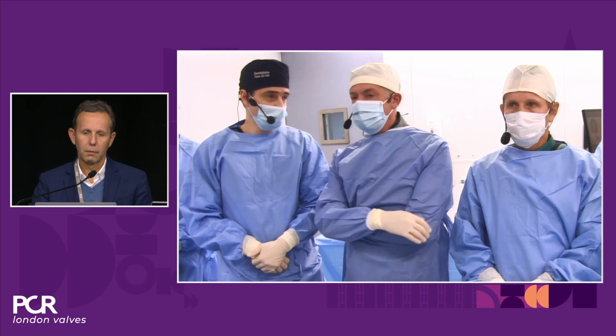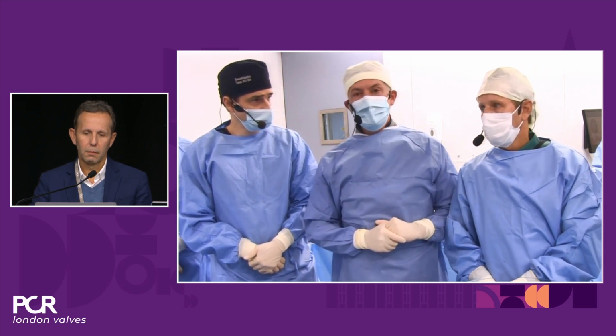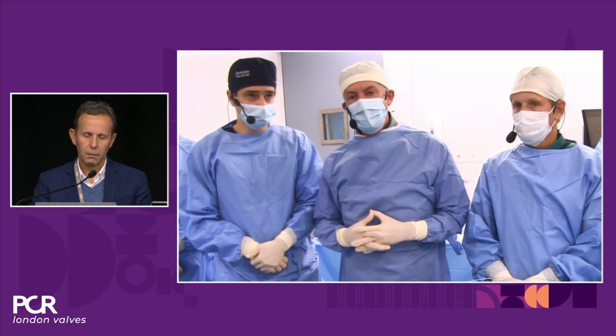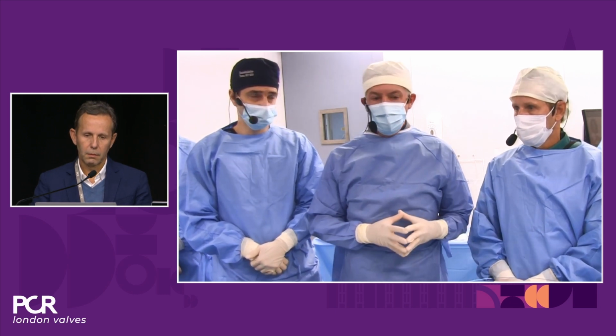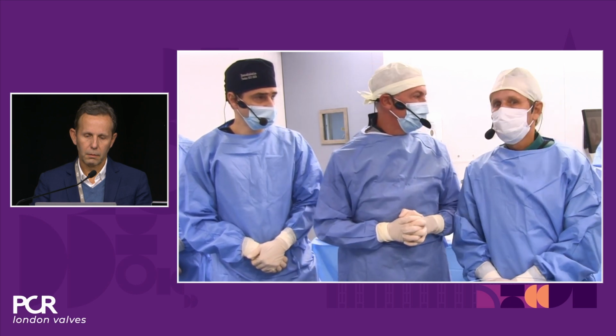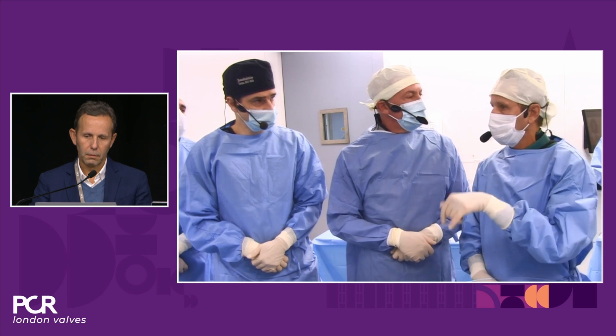So it's certainly an open field for improvement, right? And it's a great opportunity for us to discuss with you a novel device that not only protects the brain, but also the full body. I think more debris to the kidney in this patient can be catastrophic as well. Yeah, I think you should also mention that the patient is in the study, right?